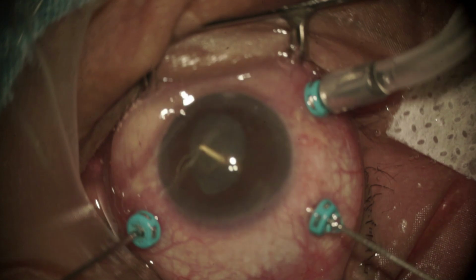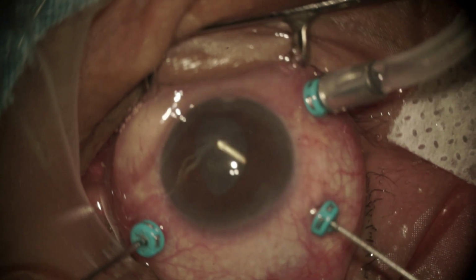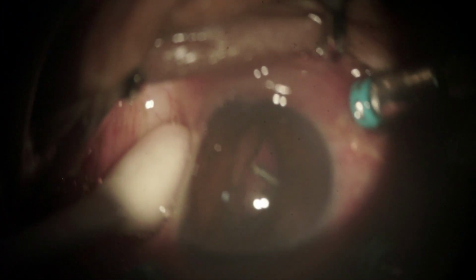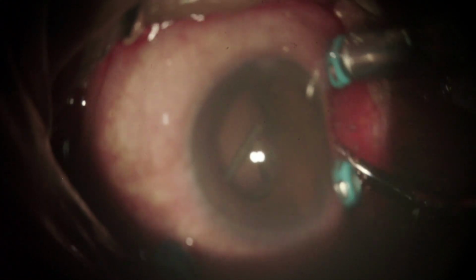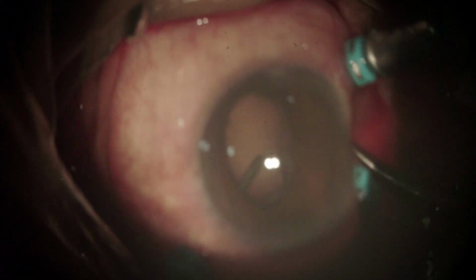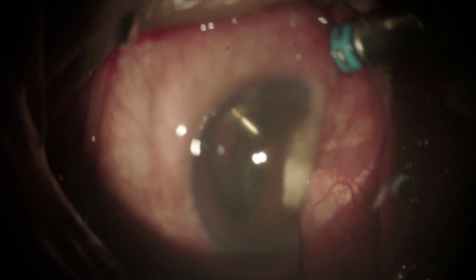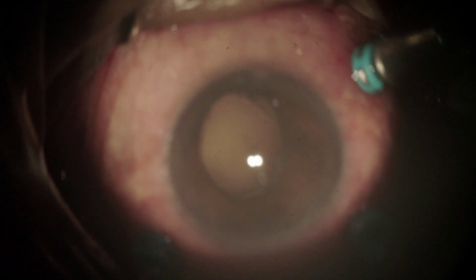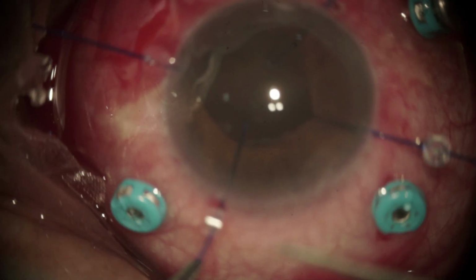The posterior capsule attached to the iris is cleared and base shaving is completed by peripheral indentation. As it is a non-dilating pupil, 4 iris hooks are placed.